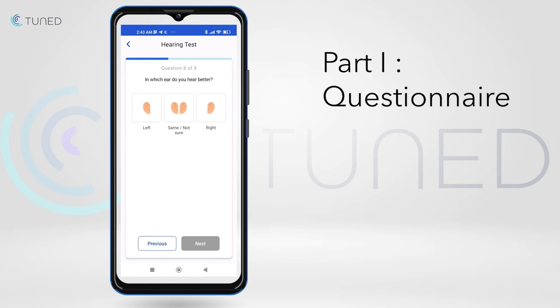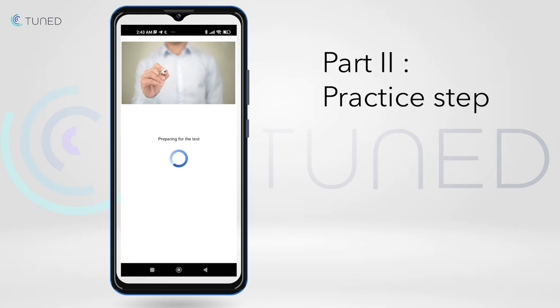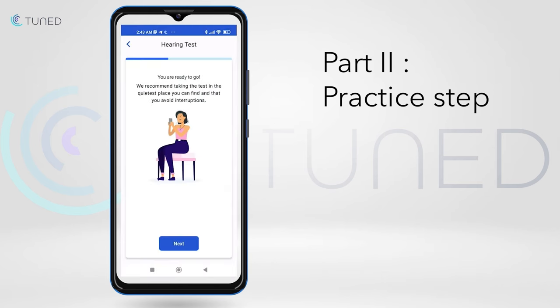After the questionnaire, the user will start the hearing test with a practice step. The goal of the test is to find the hearing threshold for each testing frequency.